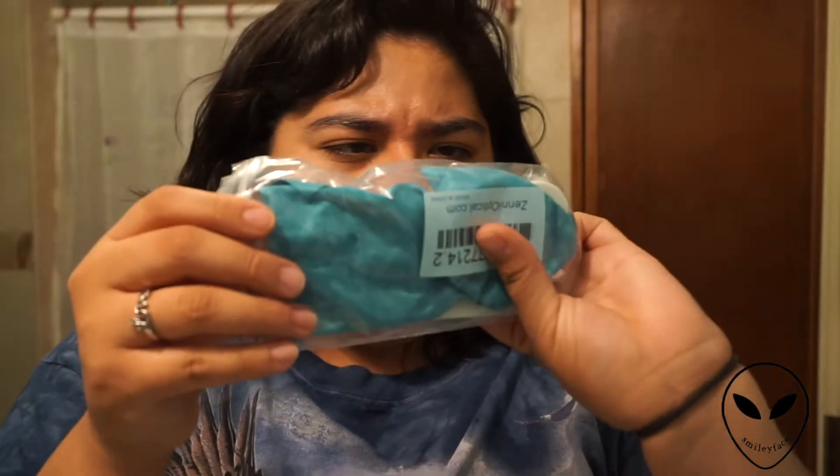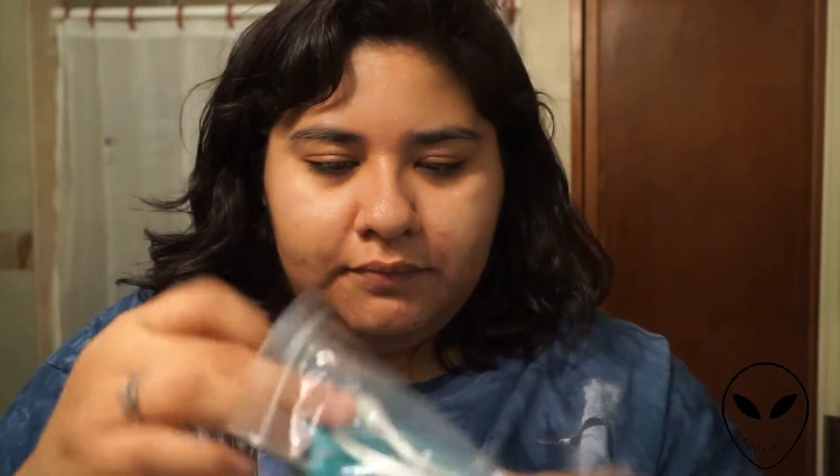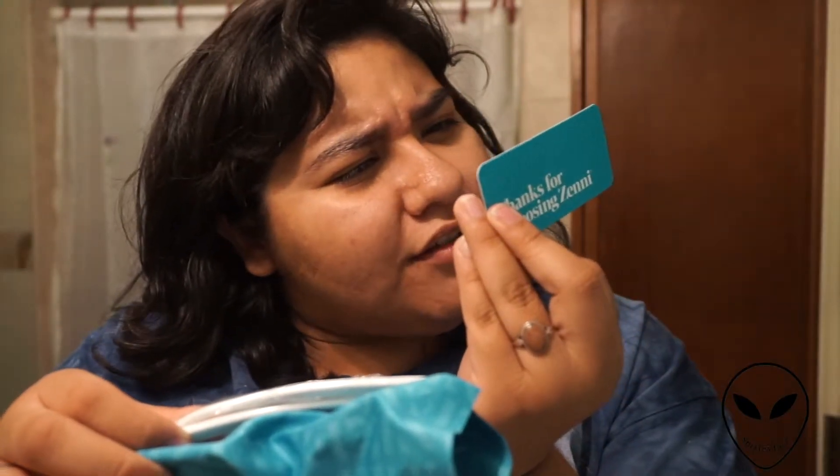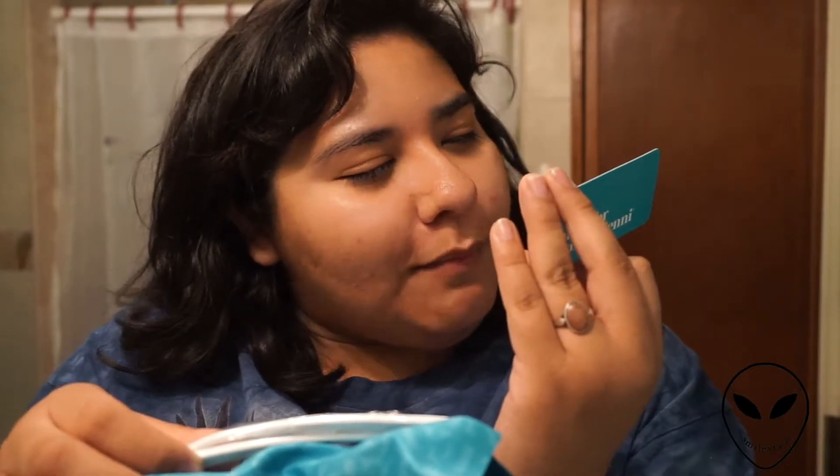Again, it comes in a bag with your order number on it. It's got a card that says 'Thanks for choosing — congratulations, you just upped your frame game. Share a pic on social media with #JustGotMyZennys.' So cute. I'm going to put these on my face and show you guys.